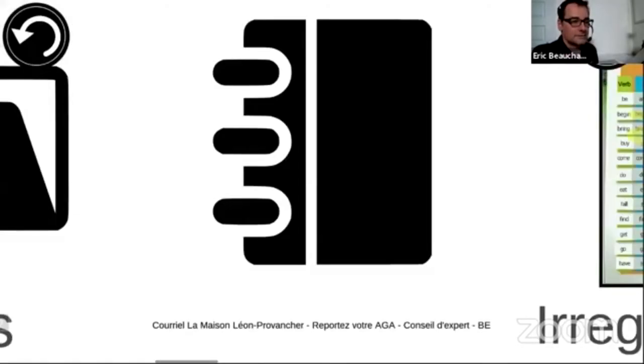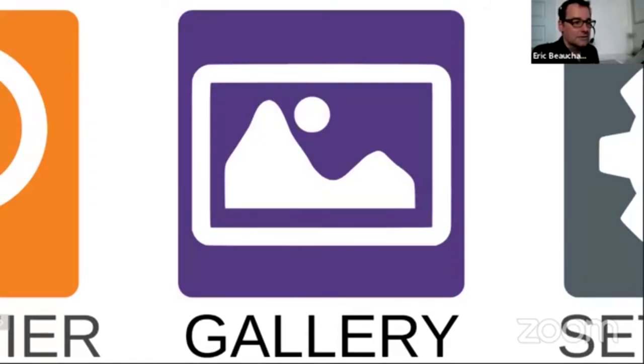Very good. So we have another question here. My student uses TalkBack. He also has the voice feedback turned on for his Prodigy. He needs to be able to turn TalkBack off or back on quickly. He has a new model unit and the TalkBack shortcut one's not working. He is very experienced in Android. Okay, so since we're using Android 6, there is a shortcut to stop or pause TalkBack.